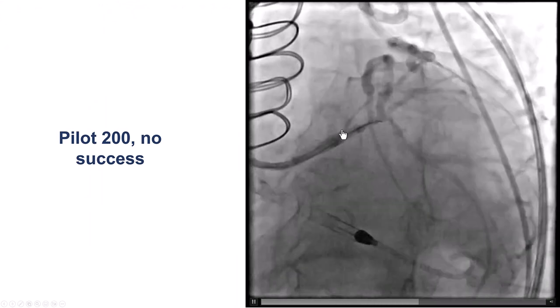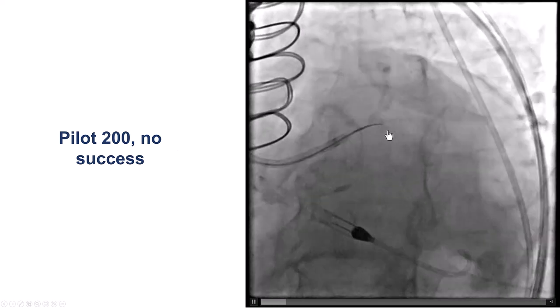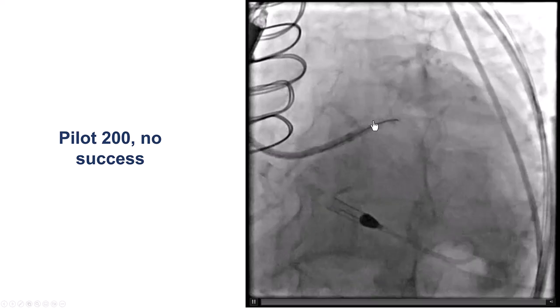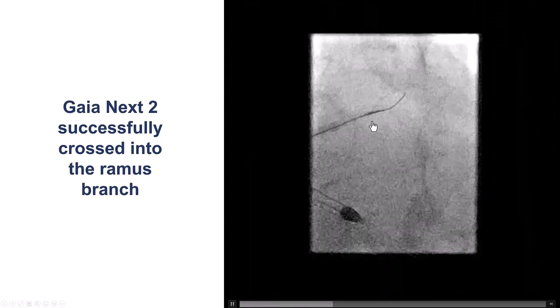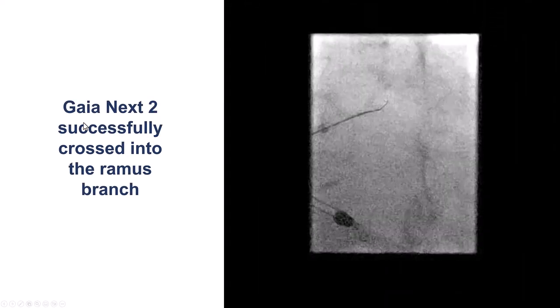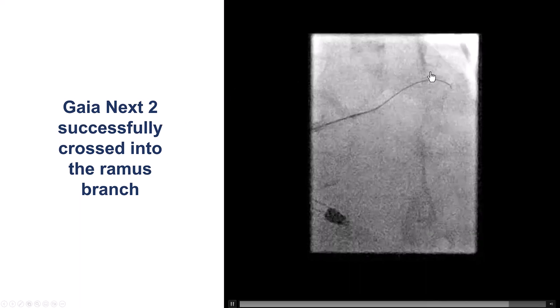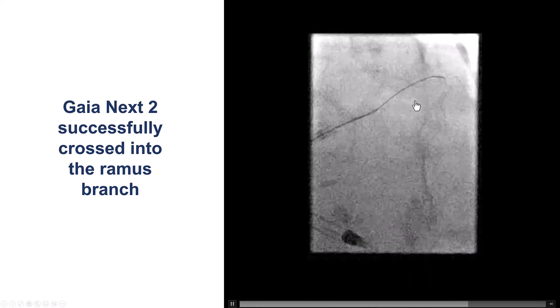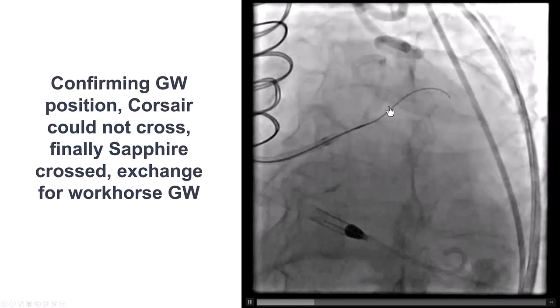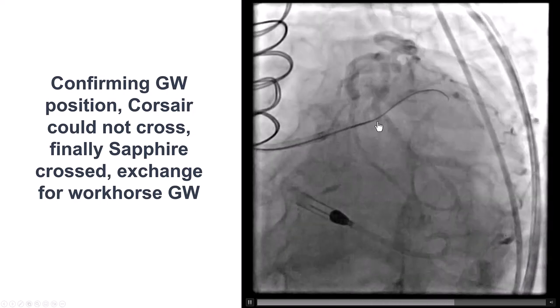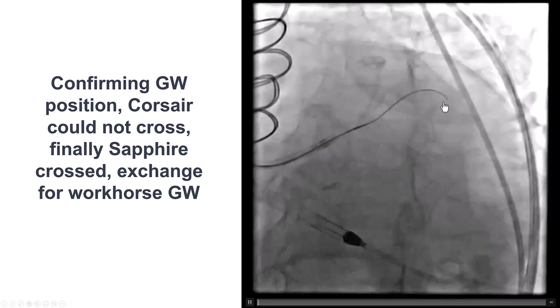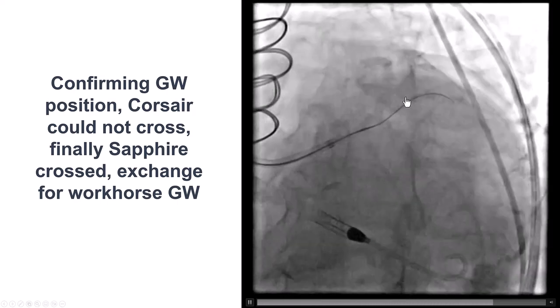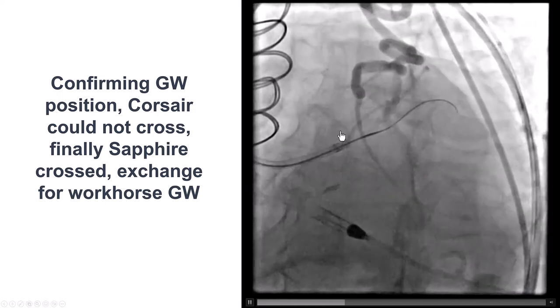Using an EBU guide and microcatheter, a Pilot 200 stiff-tip polymer-jacketed wire was tried initially but was unable to penetrate despite the short occlusion length. However, using a Gaia Nex 2, the wire was fairly quickly advanced into a branch. Contralateral injection from the LIMA confirmed this was the Ramus branch. The guidewire had entered into the Ramus branch, and the next step was to advance the microcatheter and switch the Gaia for a workhorse guidewire, but nothing would cross.